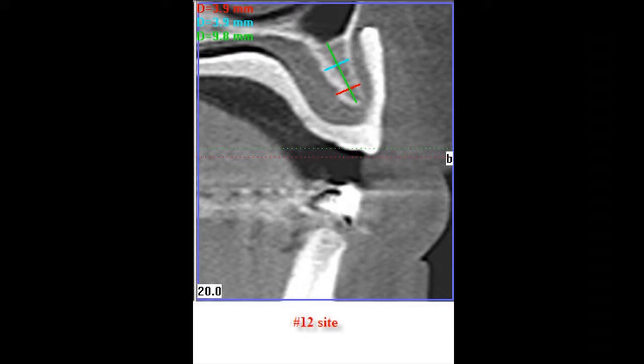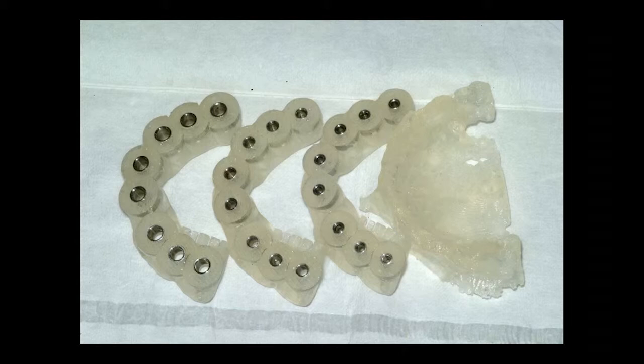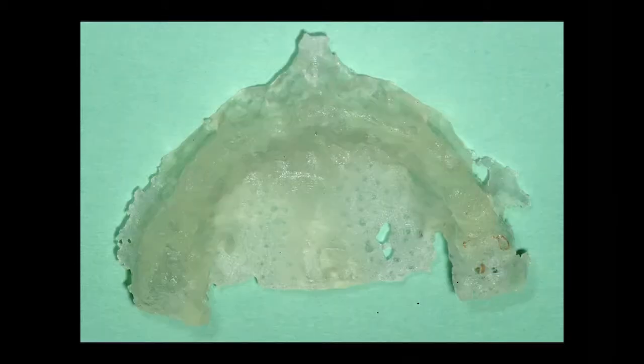There's cancellous space right here. And so we've got a game plan. And so I decided to do guided surgery. When we do guided surgery, we make the guide to fit on the bone, not to fit on the soft tissue. Because I promise you, if you make one of these and you bolt it in their mouth and you just drill through, there's no way it's going to bisect those thin ridges just right. I mean, it just isn't there. It's accurate, but I don't think it's that accurate.